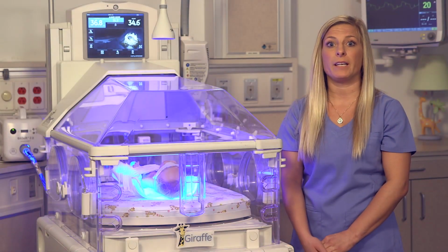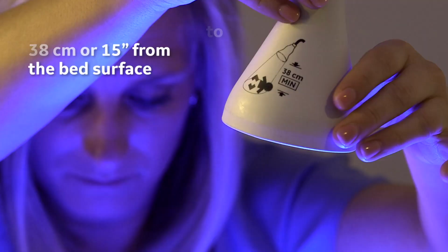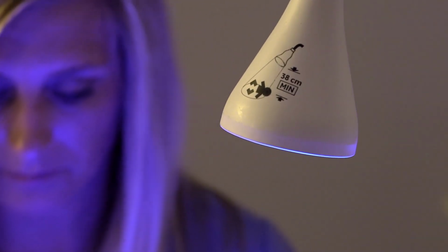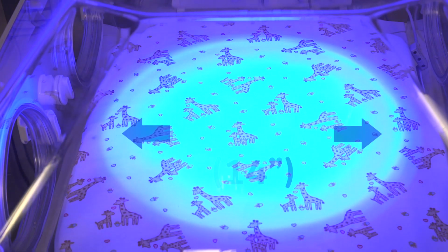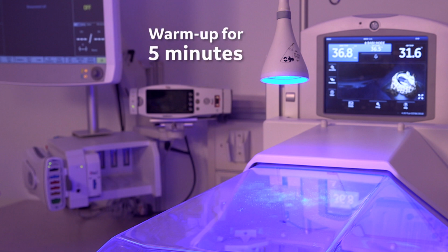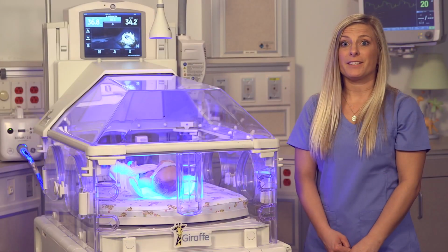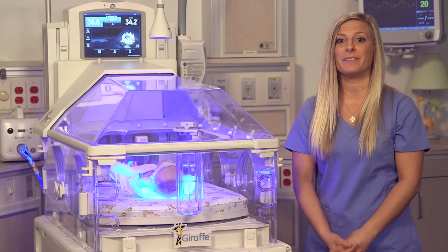Focus the therapeutic light such that the shade is 38 centimeters, which is 15 inches from the bed surface. Or you could measure the spot diameter to be 35.5 centimeters, which is 14 inches. Allow the Giraffe Blue Spot PT light to warm up for 5 minutes. From my experience, this is when I would go look for the Bili meter. This is probably how long it takes to find one.